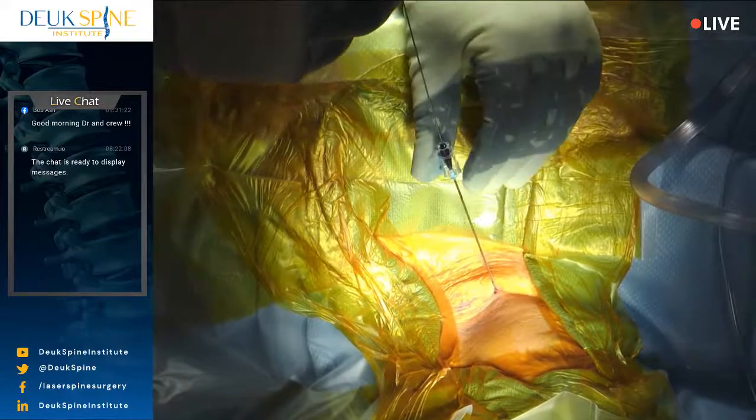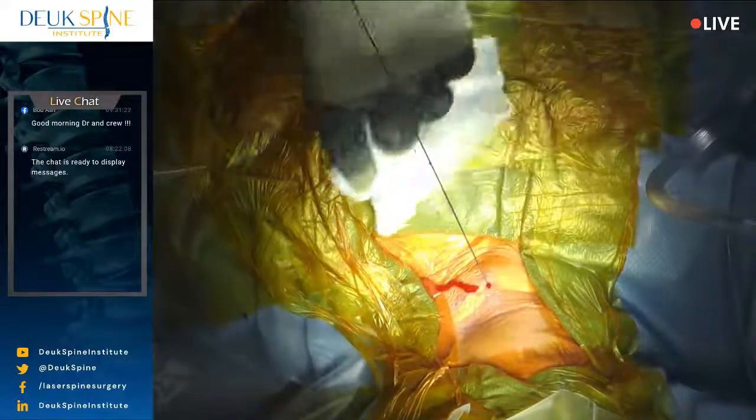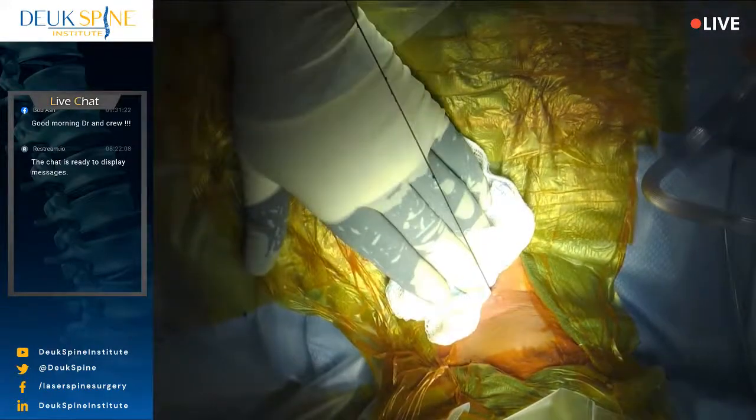Now I'm going to remove the needle and leave the guide wire. And the guide wire serves as a guide. Okay? It's kind of like if you go travel somewhere and you need to find your way around, you get a guide. A guide will show you where to go and where not to go. Okay? So it's important. Guides take you to the best way, the best route, if you have a good guide, and this is a good guide wire. They take you the best way to get somewhere, from point A to point B, from one place to another, from the start to the destination. Okay? Is there epi in there?